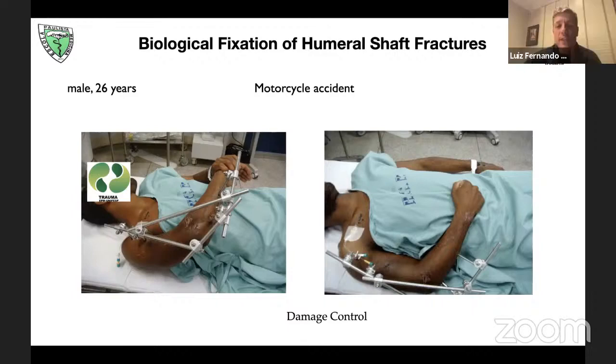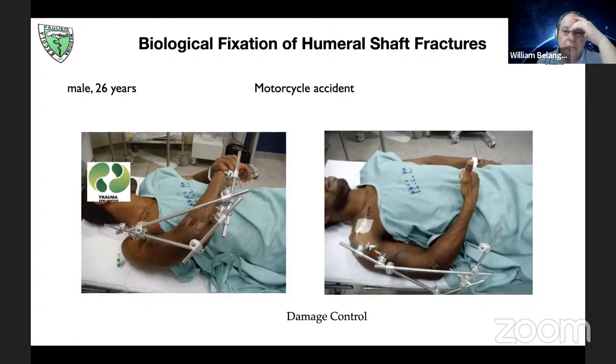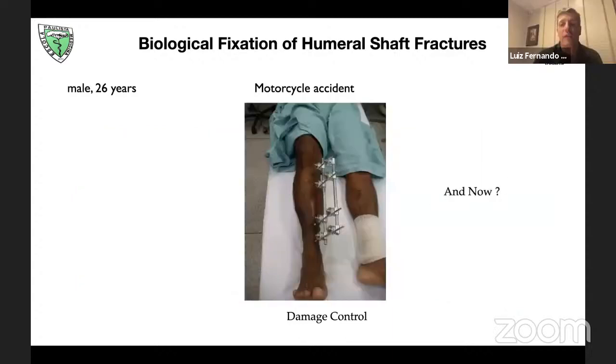Definitely, I agree with all the talks that you had, because we decided to preserve the soft tissues. We have time now to think about what to do, because we have stabilized the fracture and preserved the soft tissues. So we can think about where to use the Schanz pins, preserving the distal fragment that we know is short. I don't want to put a Schanz pin in a small fragment. So we decided to use the forearm and the proximal humerus, and preserve the distal fragment. When you do things like these, we have to check before and later what's going on with the radial nerve and whether it's still working. So we decided on damage control.